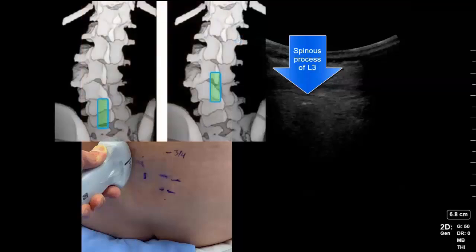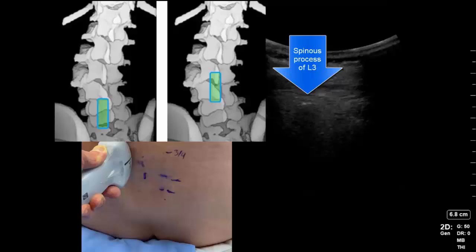This is a clue that the patient has a lumbar scoliosis. As the probe was slid cranially in a vertical line, instead of visualizing each lamina in turn, the spinous process enters the beam instead, as the spine curves to the left in this case.